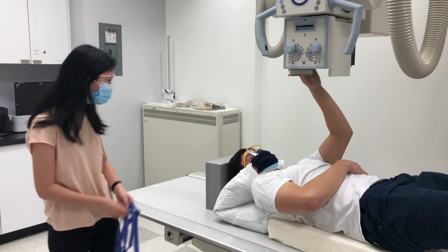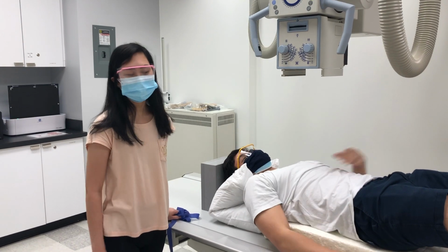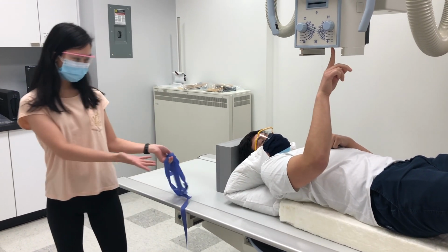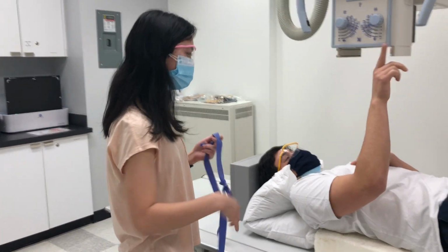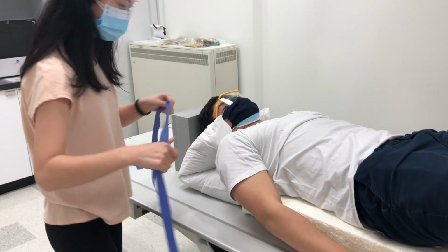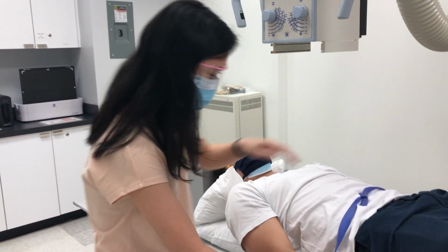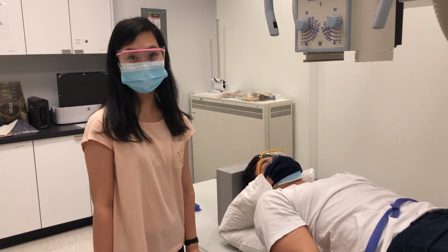All right, I need you to hold your arm still for this picture, okay? So, his arms still, but we need them out of the way for the picture. So we're going to use this octo-stop and use this Velcro to keep his arms down. Can you put your arms by your side for me, buddy? Good. No. Keep them down. Now they'll be out of the way for when we take the image so we can get the best quality diagnostic picture.